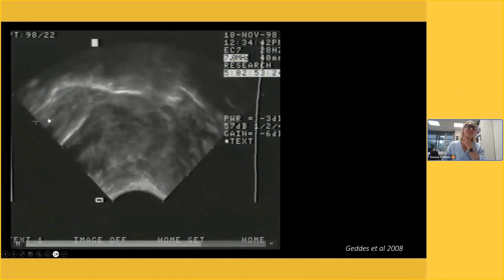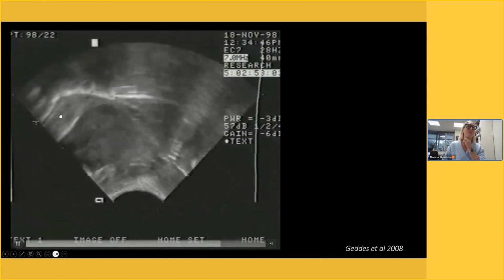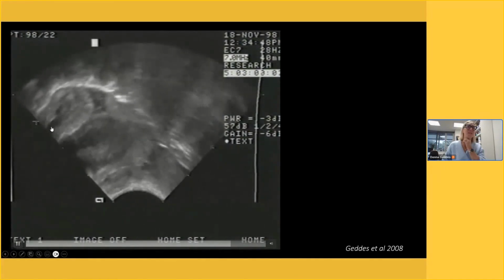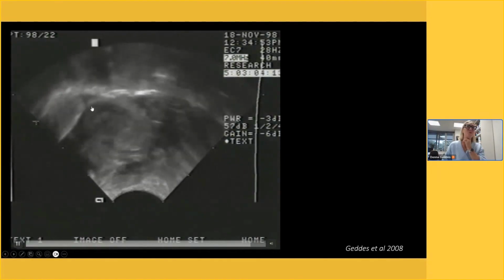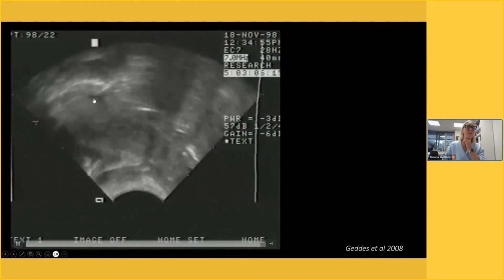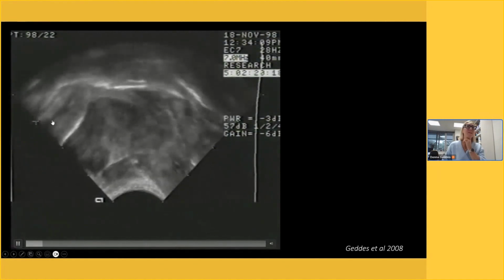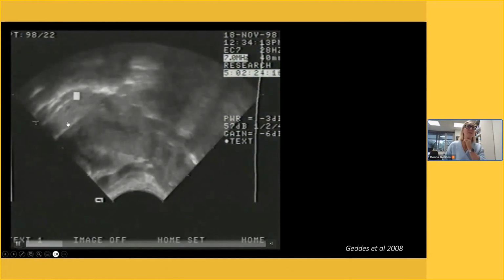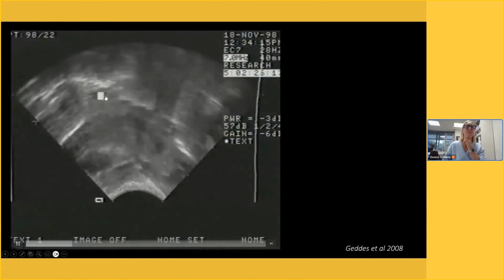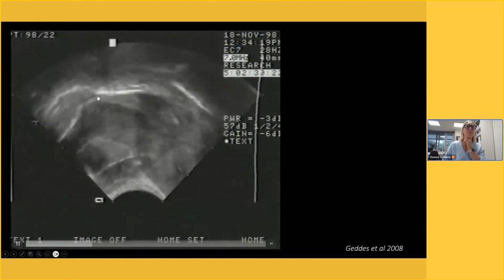As I said, you can see the nipple. When it's compressed, it shuts the milk ducts down that you can see in the nipple here, these black areas. As the baby drops the tongue and applies a vacuum, it expands the nipple and these ducts open up. And when the tongue comes down, the nipple expands, ducts open up, vacuum's applied, we can see milk flowing here, right?